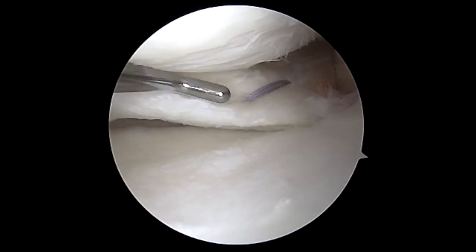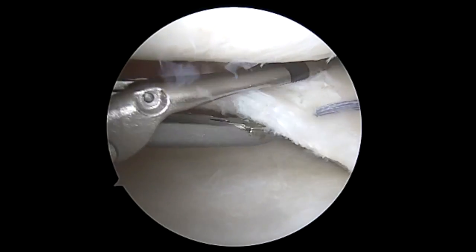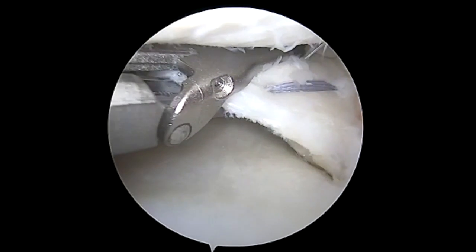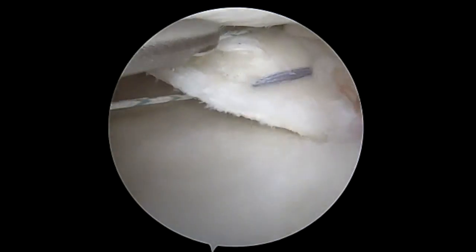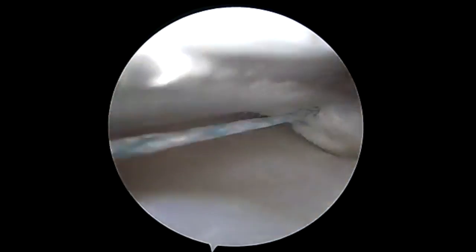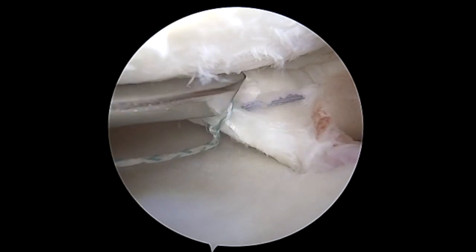Here we have it well reduced, but now you can see the horizontal component, so we're going to require a different device, and we want to get underneath both leaflets. We're going to pass this through. Again, this device works excellent for situations where we have to do both a horizontal repair or an additional vertical repair. You can see past it, this is an O suture, and then we're going to do sequential half hitches, keeping the knots underneath the meniscus.